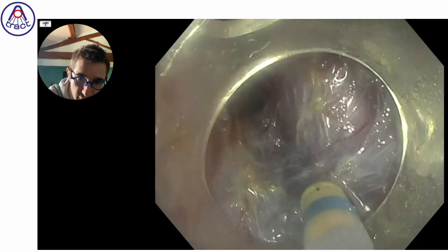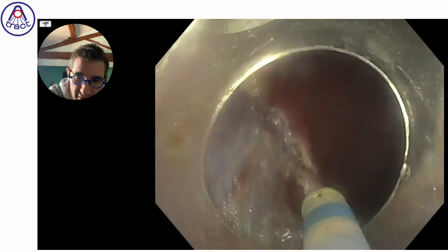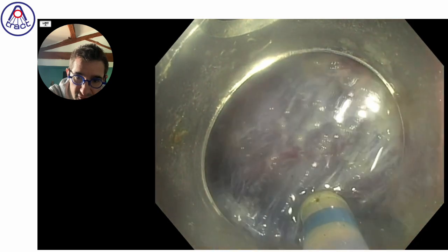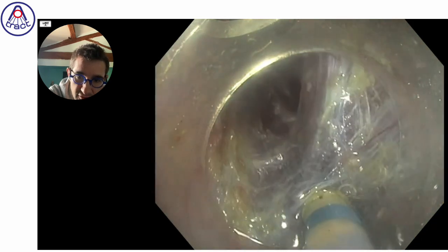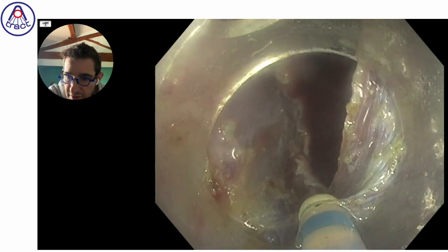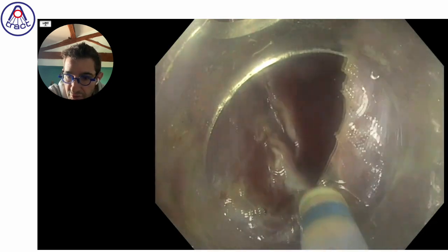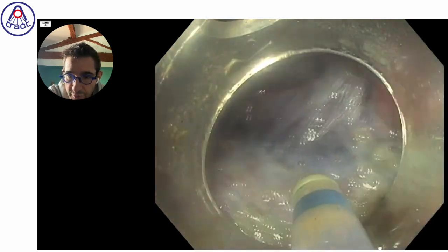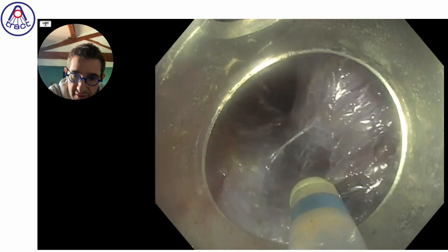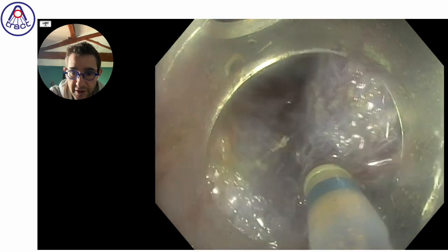So here you have the blue, you don't really know how much you can cut, but once you are on the edge like this, you can see in transparency how much you have to cut, and therefore you can go faster by pushing more your knife, being sure that it will not go on the muscle because you are seeing across the remaining fibers how much remains to be cut.